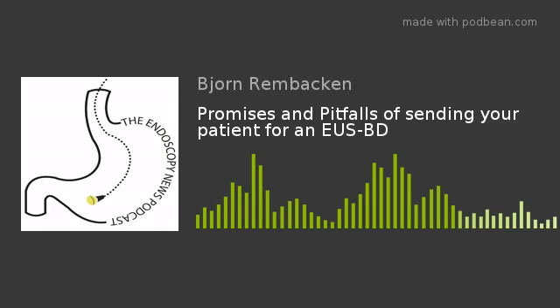For many reasons, including the fact that we just didn't have the experience that we have now, we were doing them in separate sessions. So we were bringing them on one day for the EUS-guided biliary drainage, which, to be fair, was taking a lot longer because we were more naive about them, and then bringing them back on another day for the gastric drainage procedure. But you can do both procedures together within about 20-25 minutes. If you're doing an EUS-guided gastrojejunostomy, we can do both procedures within about 40 minutes.